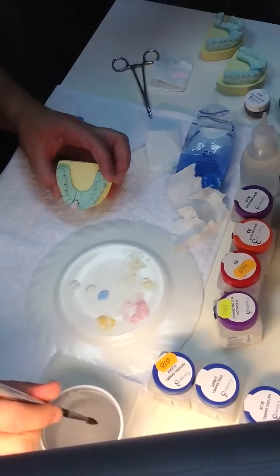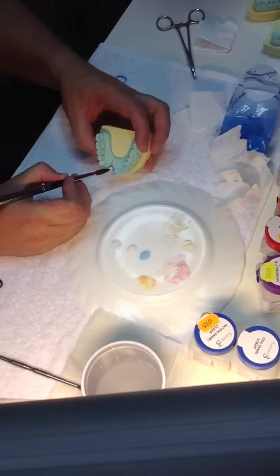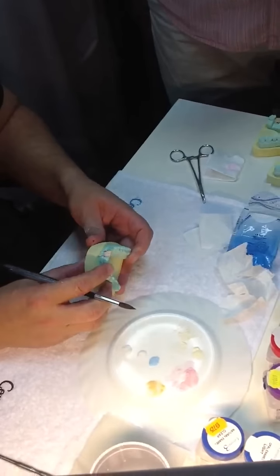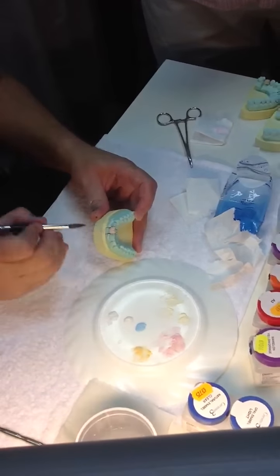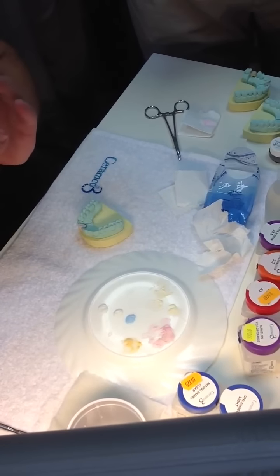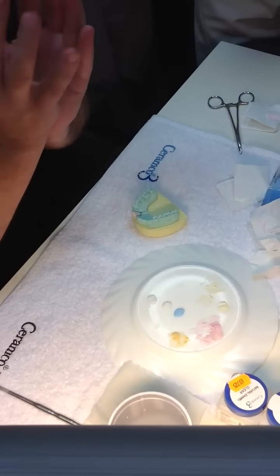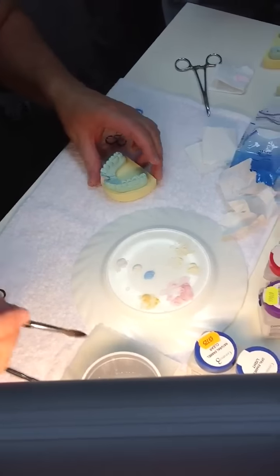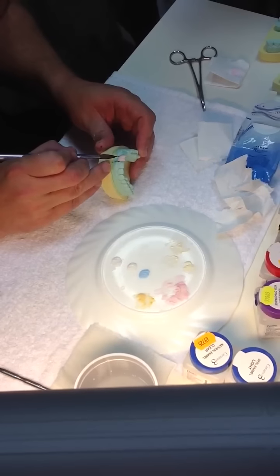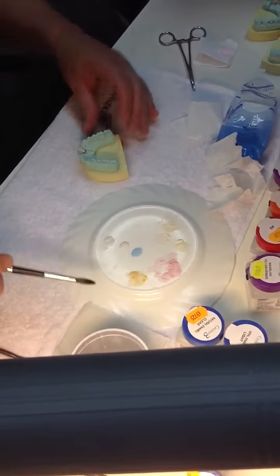Just put some water on the palatal, and that's got to get drawn through. Add moisture from either side. If you try to add directly onto the dry porcelain, often you can get a separation of the two. So you'll have the dentine, and then the enamel will lift away from the dentine when it fires.